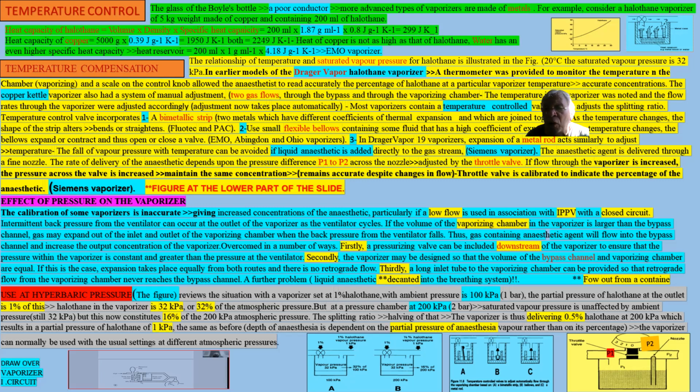All of these contemporary vaporizers, the vaporizers we are used to, are not affected whether we go up with high pressure or down with low pressure, as when working in a hyperbaric chamber. It's not affected much by the pressure. What's the meaning of that?